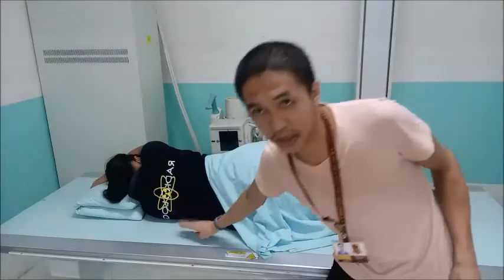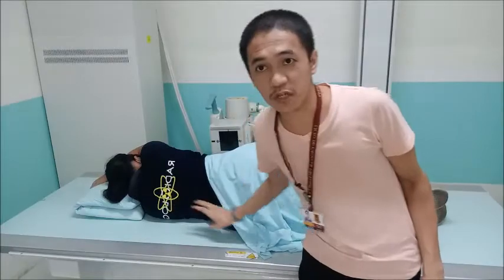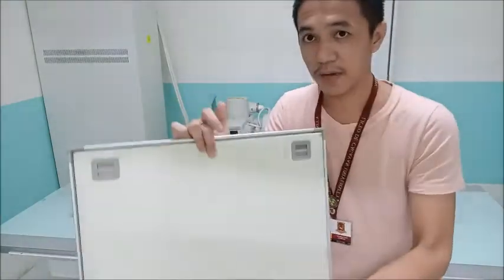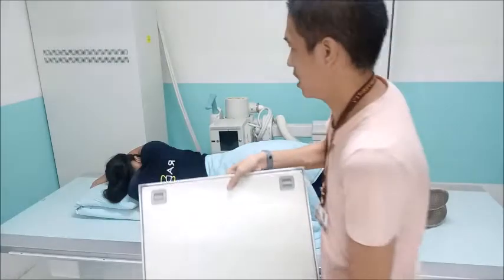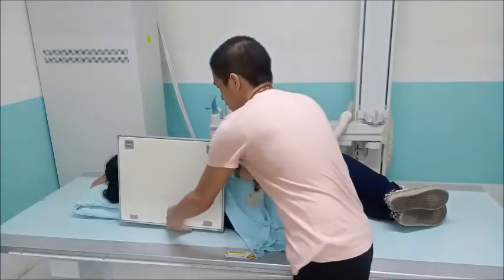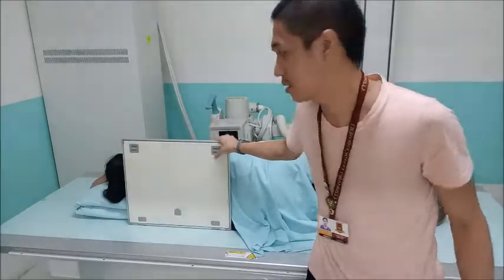So again, it is important to have a foam wedge, at least about 5 inches, on which the torso of the patient will be elevated. Okay, and then you have the IR again, opposite the X-ray tube. The relationship should still be the same as in a chest AP. Yeah, they are still perpendicular.